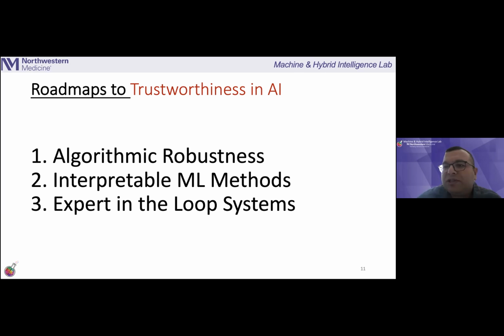Human recognition is superior to computers. The deep learning algorithms are really great in local tasks, so we can combine them, not as a secondary opinion tool, but let's do a true collaboration in real radiology room settings, where they can teach each other.